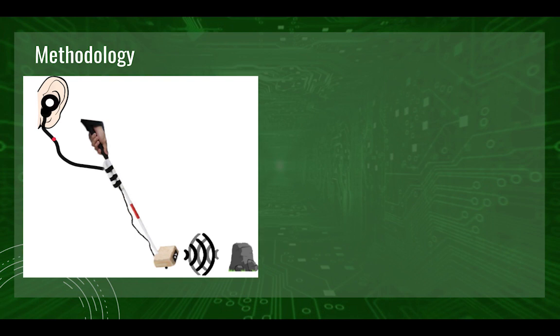Our design implemented an acoustic feedback system using 2 piezoelectric buzzers. Buzzer A, which is for distance measurement, would produce sound at a higher rate as a sensor nears an object, similar to a car parking. Buzzer B, on the other hand, is for solidity determination, wherein at a specific distance it will sound off, determining how solid the object is through various sound frequencies. These components were placed in a box attached to the end of the stick. The system is then powered by a power bank that is attached near the handle of the stick.